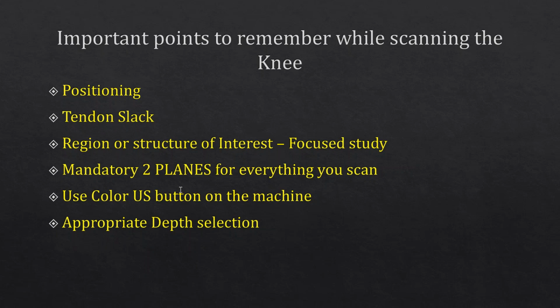Or if it's just the compression, you will see the same picture that you will see with every entrapment, focal nerve swelling or hourglass deformity of the nerve, and that is the presentation with all types of nerve entrapment, including carpal tunnel and cubital tunnel. You will see focal swelling or hourglass deformity of the nerve at the site of compression.